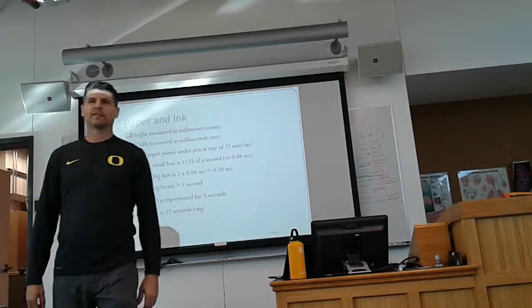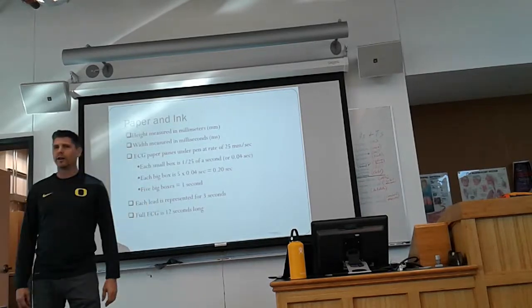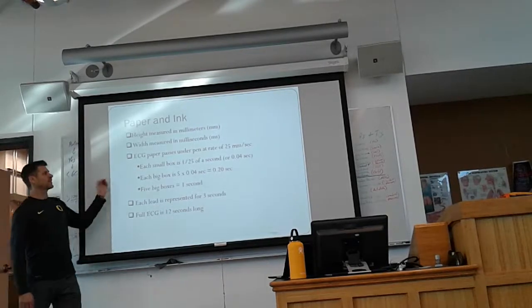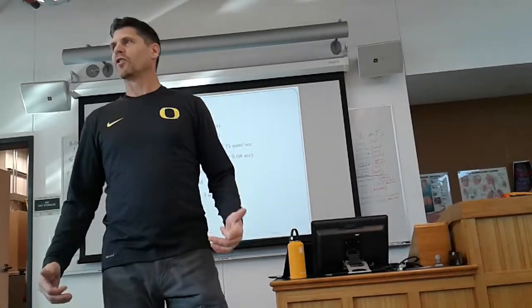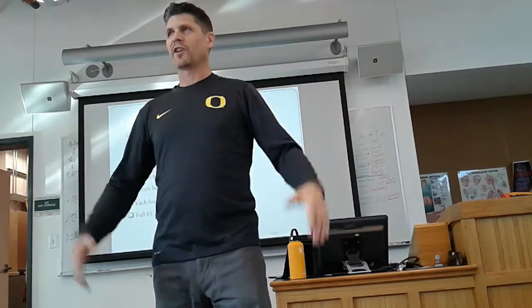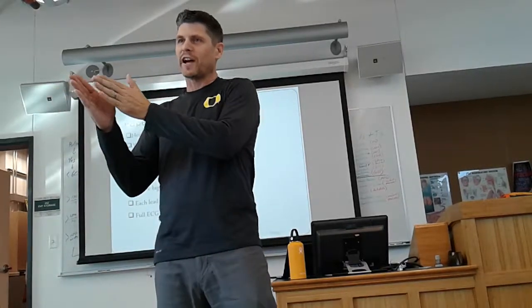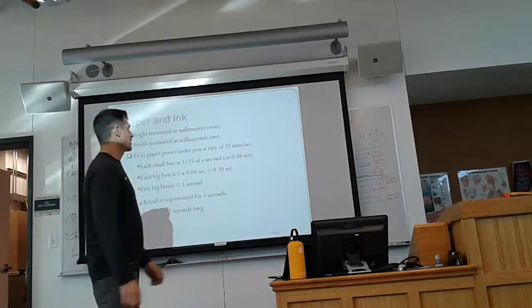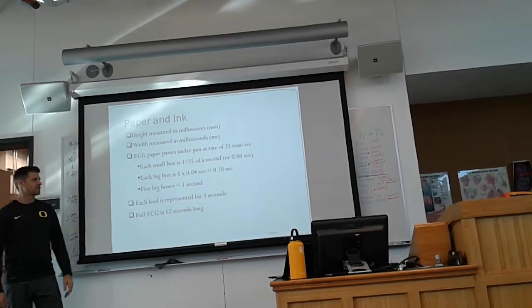So time is on the x-axis, amplitude is on the y-axis. The x-axis is measured in seconds, 0.04 seconds for every little box. The y-axis is measured in millimeters, 1 millimeter for every little box. The EKG paper is going to pass under the pin at a rate of 25 millimeters per second, which is why we get 0.04 seconds per every little box. You just told me that there are 25 little boxes in 1 second, yes? So it's moving at 25 little boxes per second, and when you divide the 1 second by 25, you get the 0.04. So every little box is 0.04 seconds and 1 millimeter, and every big box is 0.2 seconds.